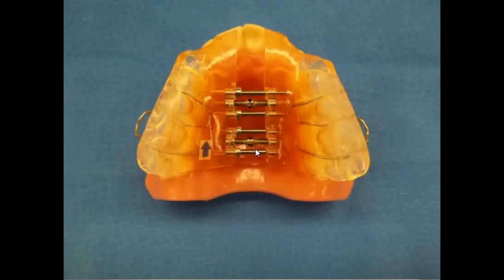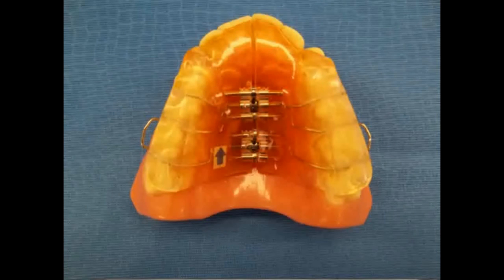The expansion should be retained for 6 to 8 months if the patient is older. The patient can wear the appliance as a retainer, or you can switch it for a fixed holding appliance such as a 3D multi-action appliance. Using a fixed appliance will allow you to start straight wire treatment much quicker.